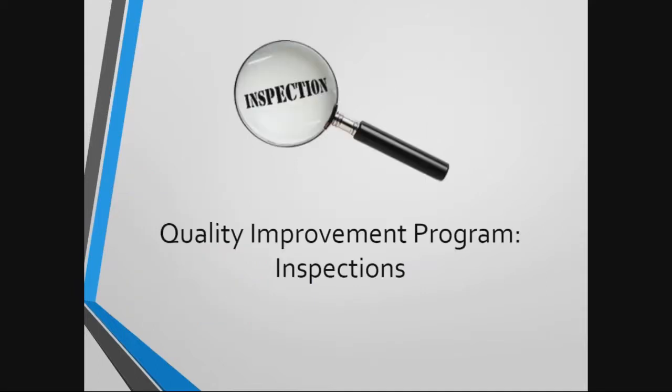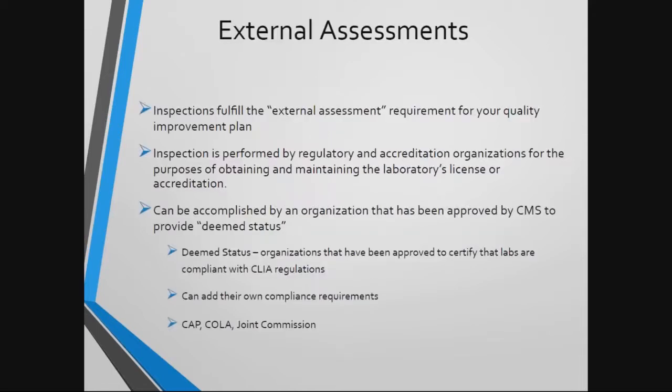So a key component of any quality improvement program are those external assessments. Inspections are a required method of external assessment. Laboratories must complete external assessments as part of their ongoing quality improvement program.